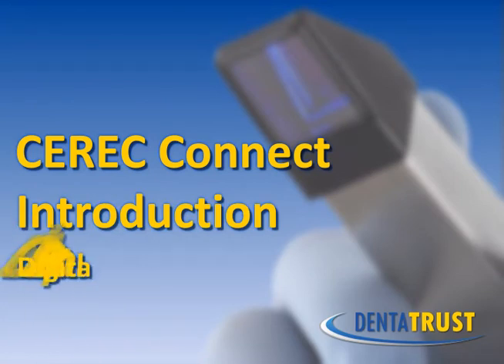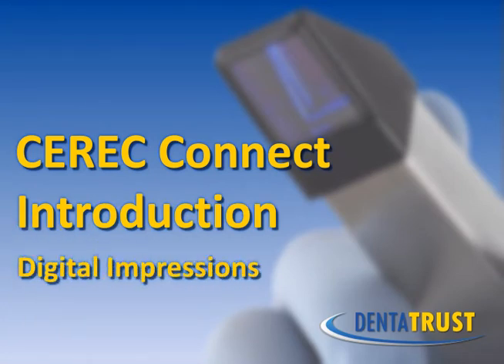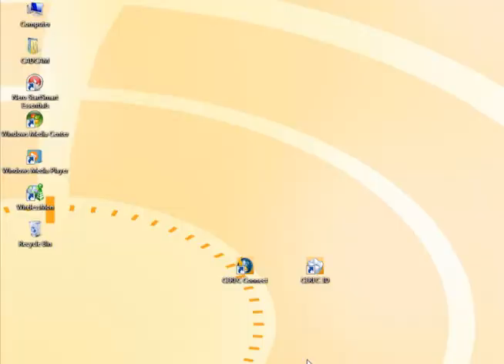Welcome to the CEREC Connect introductory video. During this video, you will learn how to set up a CEREC Connect case, take the necessary digital impressions, and send the case to the lab of your choosing.